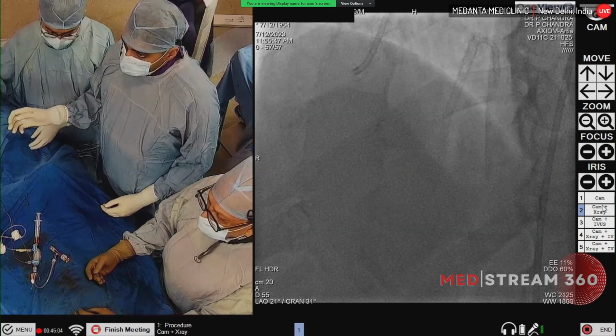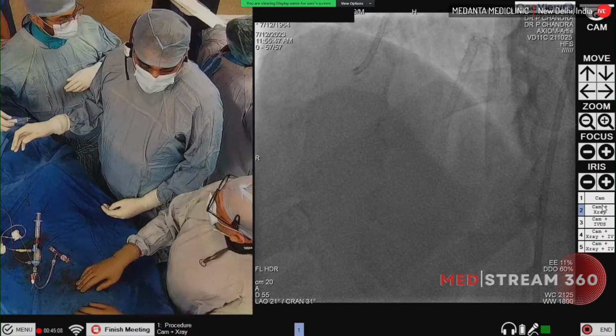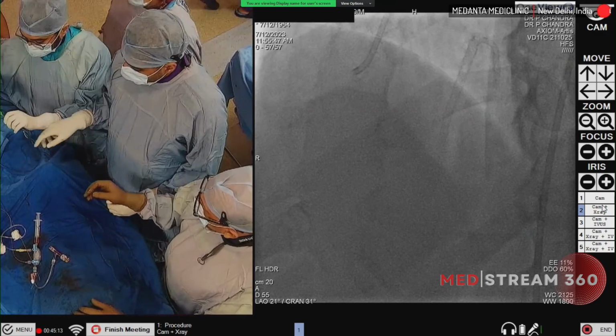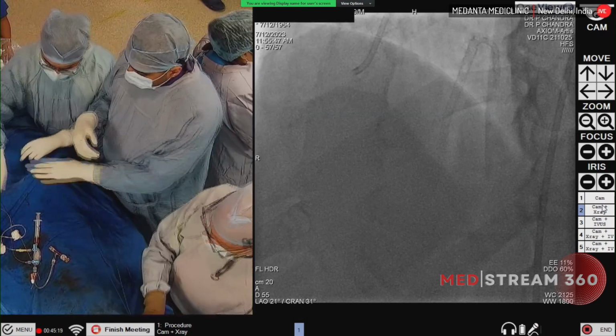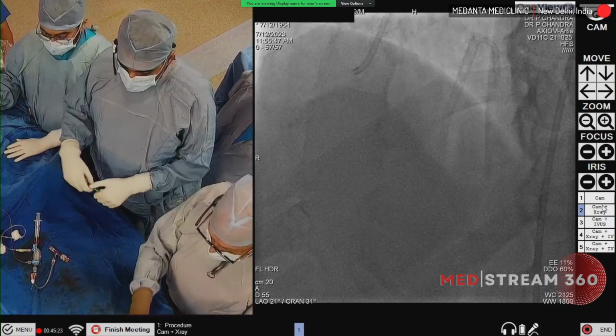And this was a bifurcation stent we did. So which year was the angioplasty done for you? 2013. So this was 10 years back. We have discussed this in the history. So the bifurcation stenting was done. Yes, bifurcation stent.